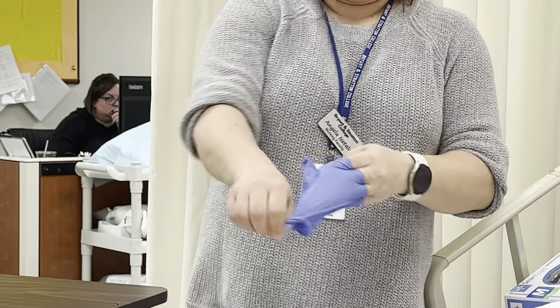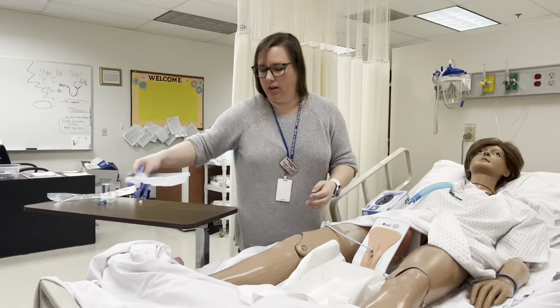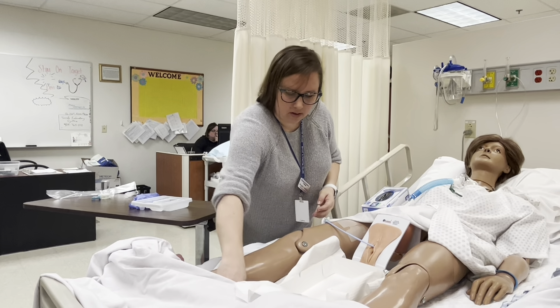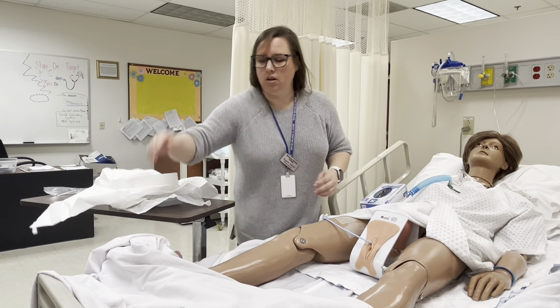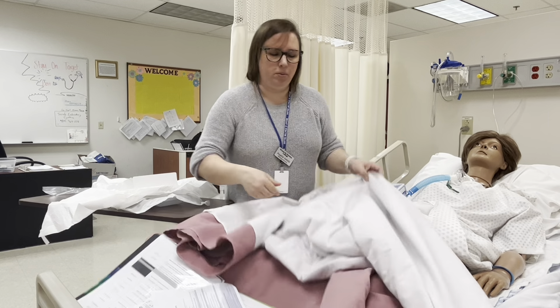I'm going to take off my gloves, clean my patient up, clean up my supplies, and make sure they're in a comfortable position.